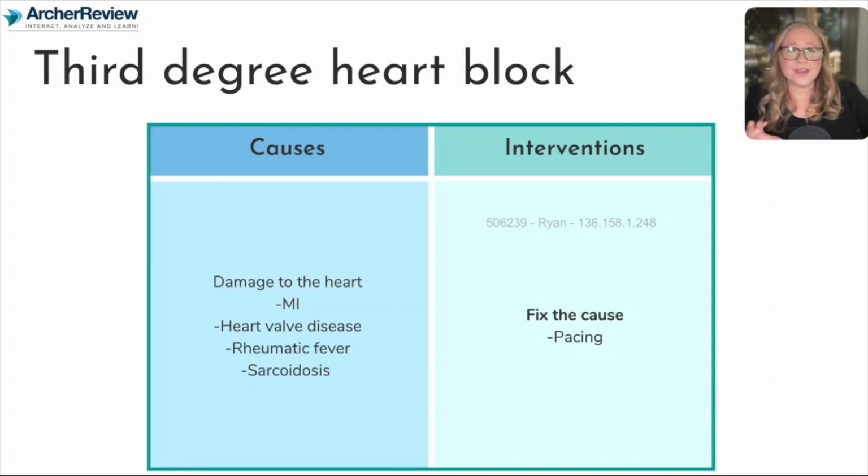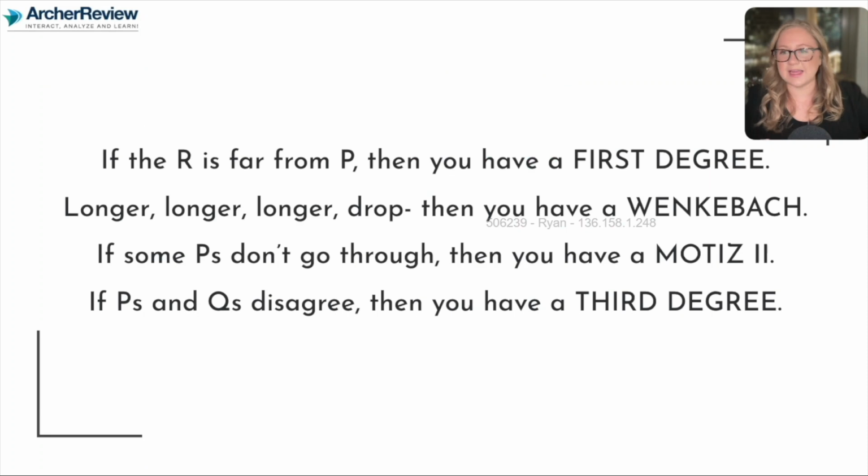So I know this can be super hard to understand. I didn't learn a whole lot about heart blocks in nursing school myself. And when I was studying for my NCLEX, I came across this awesome, silly little poem that really helped me remember these. So let's go through our heart blocks together and put them to this song.